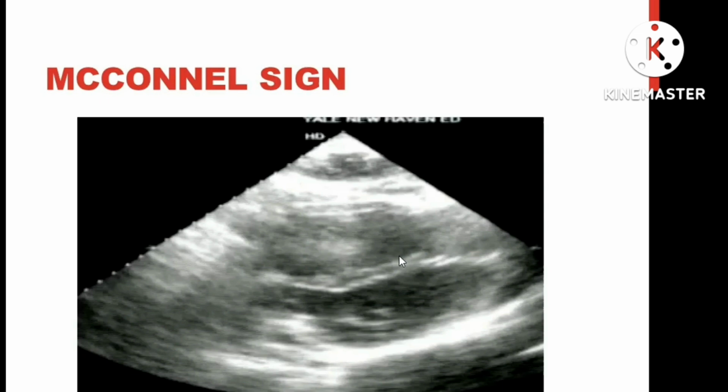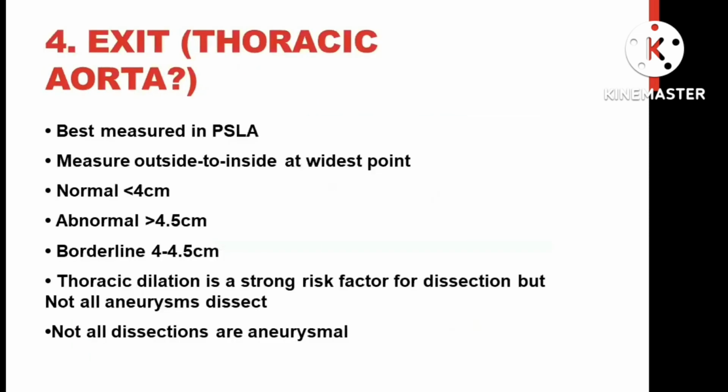It's a sign of PE. The apex is spared in PE. In addition, another sign is the McConnell sign.